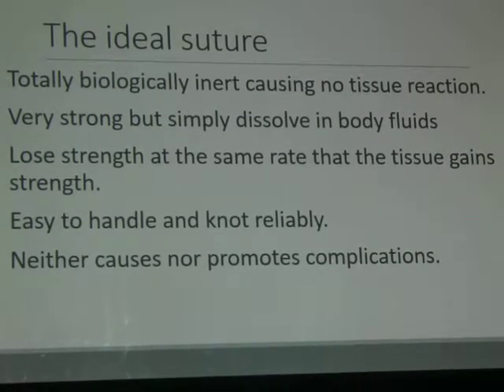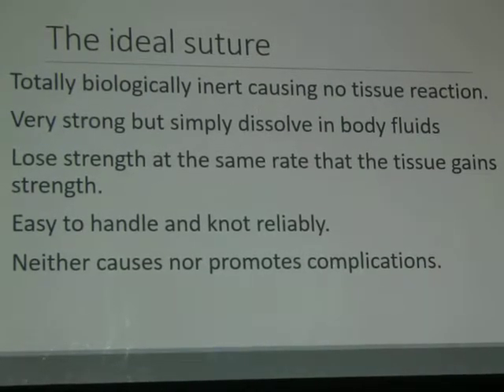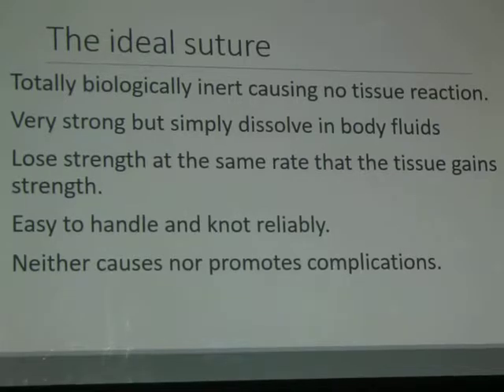It does not maintain the body in shape. It should lose strength at the same time as the tissue gains strength.